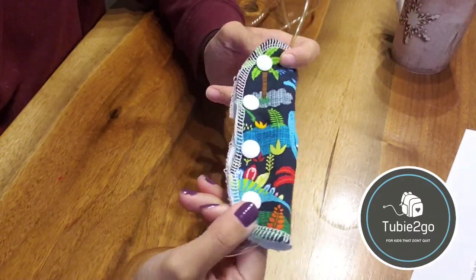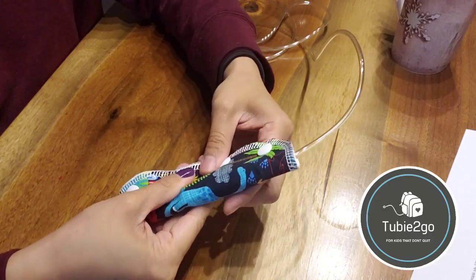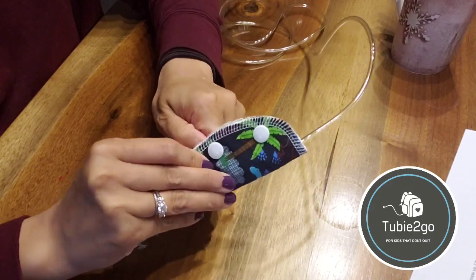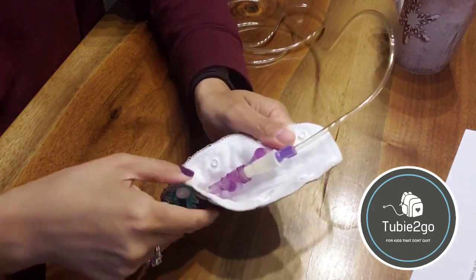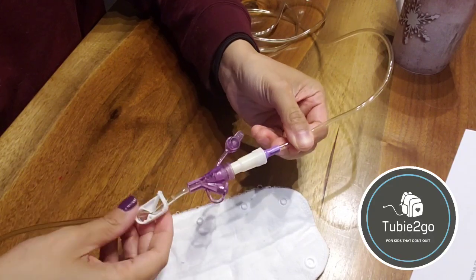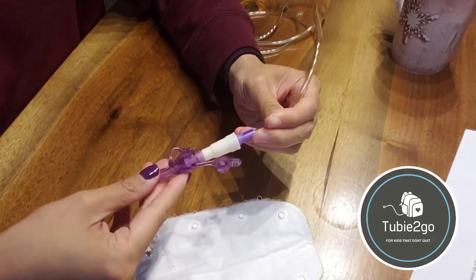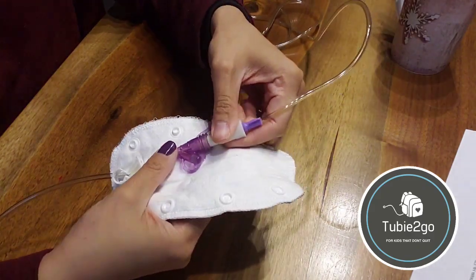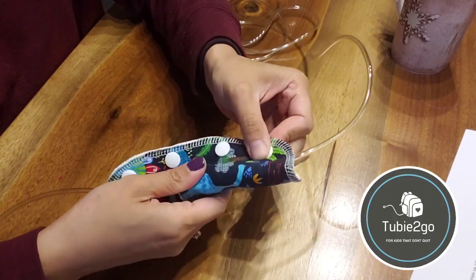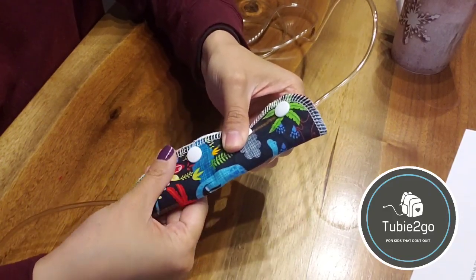Port covers come in many different fabrics and designs. This is just one example, but typically it is made up of a fabric piece with some sort of snaps to allow for easy on and off around your ports. If you face it inwards, the med port on the inside of the port cover, that's going to help prevent the med port from rubbing up against things and opening up.